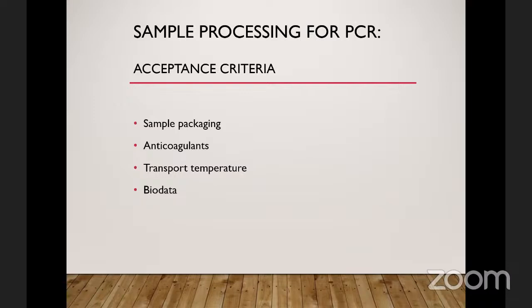So it is very important that all of this information be looked at, especially as we said that samples are coming in double packaged. You have the primary bottle and then you put it inside the universal bottle. Sometimes you are going to be seeing one name on the first bottle and another name on the second bottle, possibly because some people want to reuse bottles.